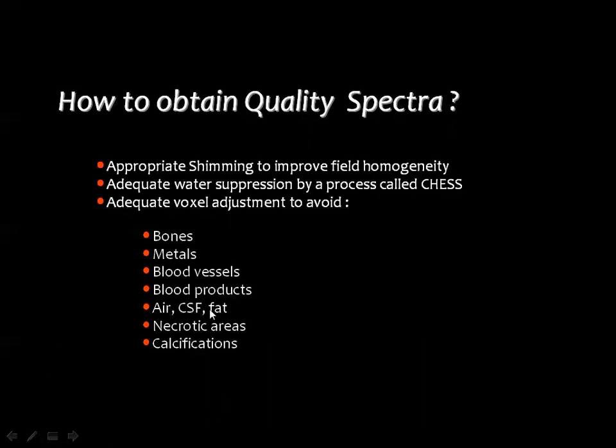Then how do we obtain a good quality spectrum? Number one, you should ensure that your magnet has a homogeneous field, by shimming or by techniques that induce homogeneity of the magnet.